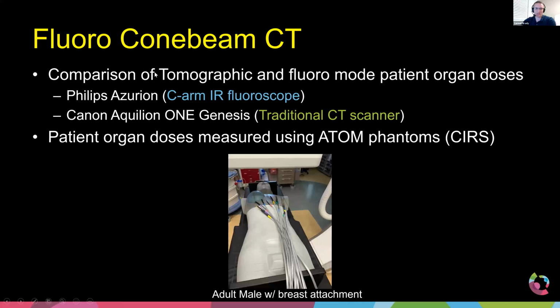All right. Now let's talk a little bit about cone beam CT. Up to this point, we've really just largely talked about fluoroscopic systems. I would argue those four principles are pretty much the same if it's an interventional system, a tilt table, a fixed C arm, or a mobile unit. Now let's talk cone beam.